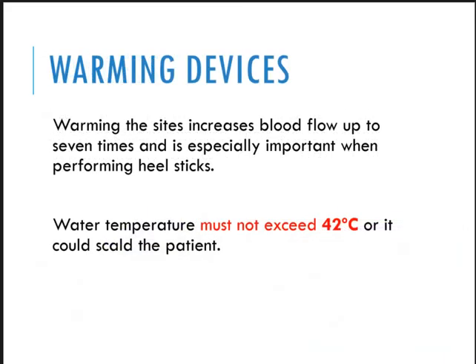Now, I think for me, this is optional, your warming devices. So, warming the sites increases blood flow up to 7 times and especially important when performing heel sticks. Okay, so water temperature must not exceed 42 degrees Celsius or it may burn or scald the patient. But what I usually do, guys, is I usually hold the hand of the patient.